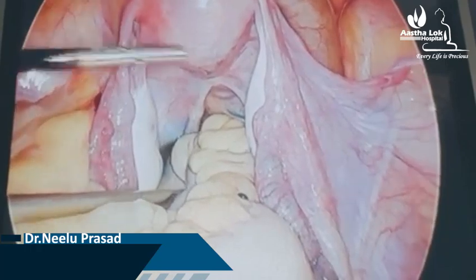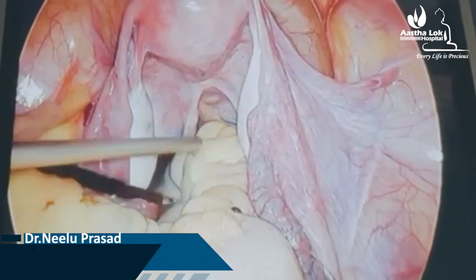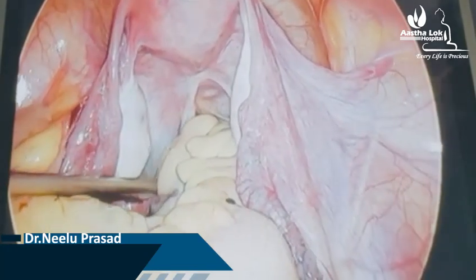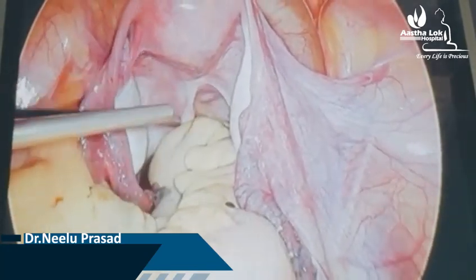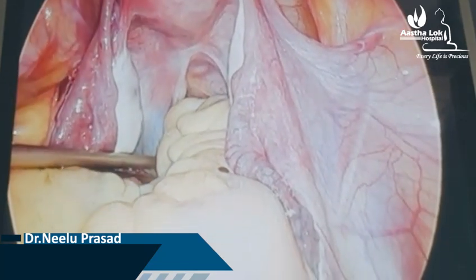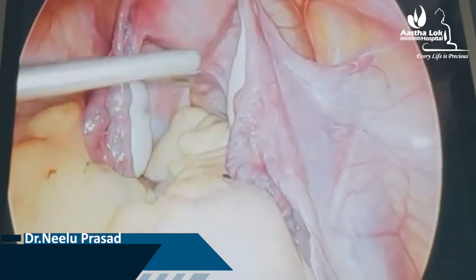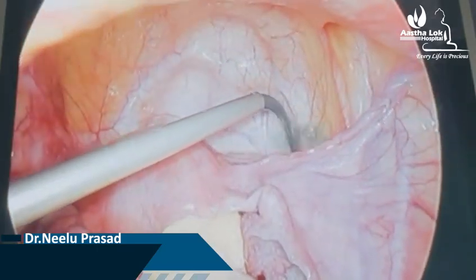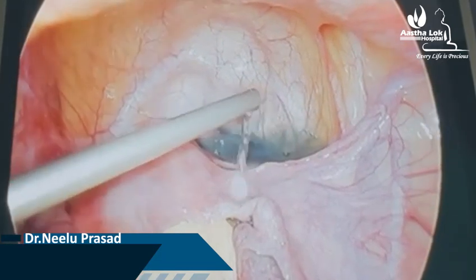So after diagnosing this patency, we just suck out the dye that is present in the pelvic cavity, and after that with normal saline we wash the pelvic cavity to prevent any allergic reactions.